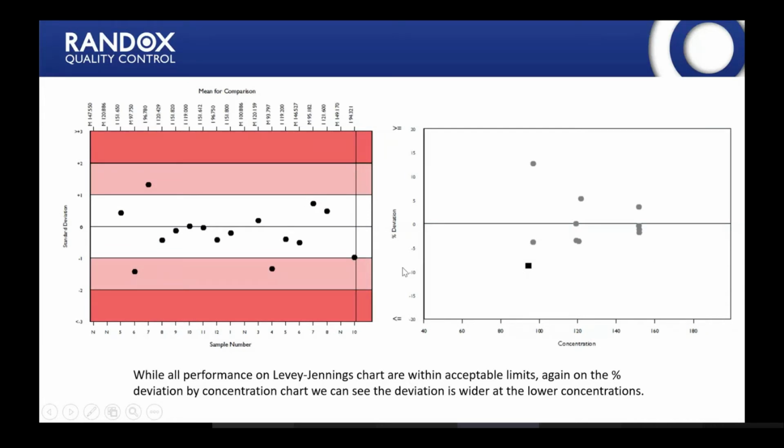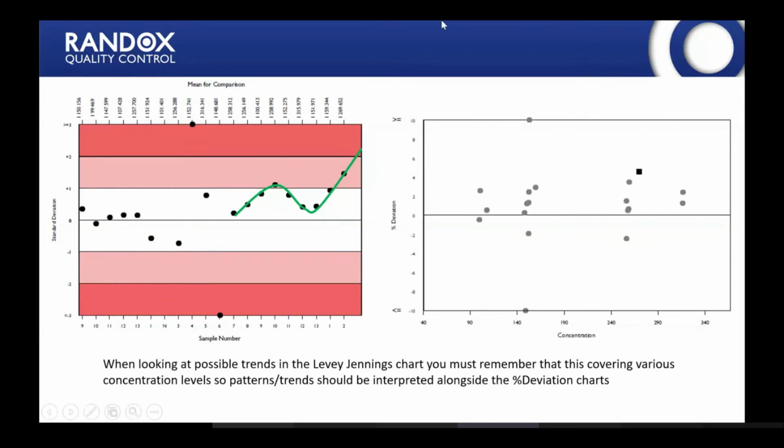So you can get a lot of information off the reports, but you need to, again, be using the charts in conjunction with each other and not alone. So here's another chart where this time you can see a pattern. So the lab's running with a positive bias, but the lab also have their results where they go up and then they come down and then they go up. And if you were looking at this, you could project that the results are going to go on up and you're going to end up being unacceptable for the next performance.